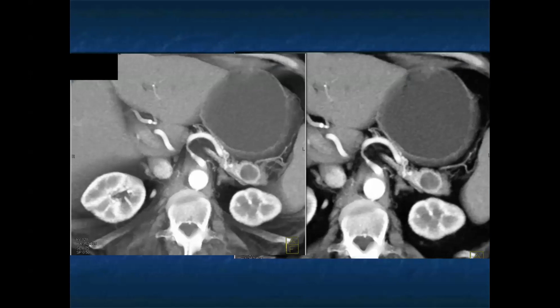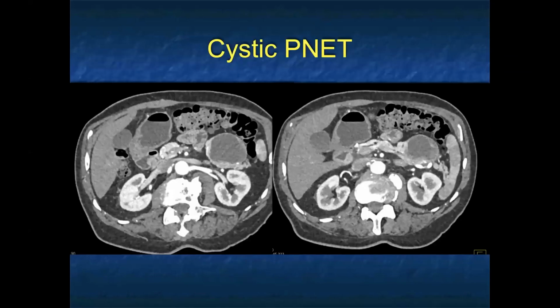Here you look at it, just say cystic lesion with rim enhancement. That's a neuroendocrine tumor every single time. Every once in a while, you can have cystic mets from renal cell, but the patient has 2 kidneys. Regardless, this is going to be coming out.